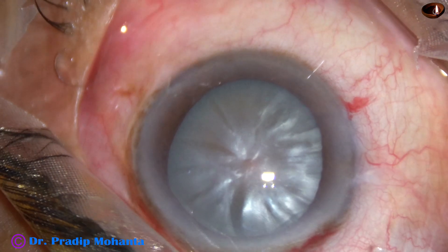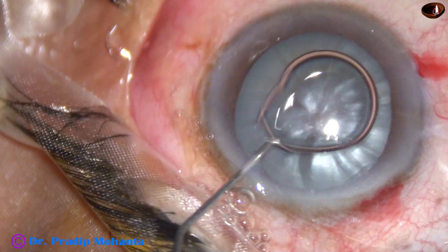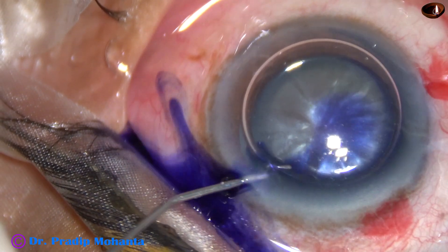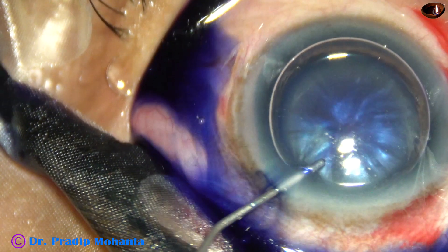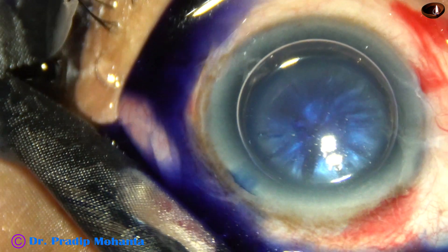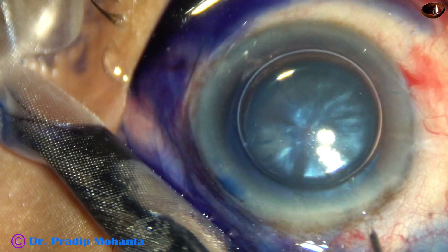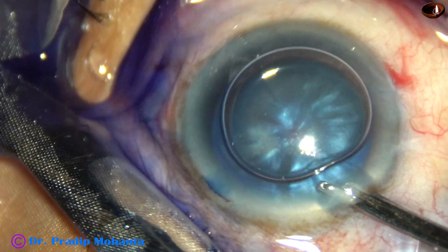By this time, the main incision and two side ports have been made. And here goes an air bubble. As I inject trypan blue dye, I find that an area just in front of the left side port is getting de-stained very fast. That means I have already pierced the anterior capsule there. So I have to manage it somehow.